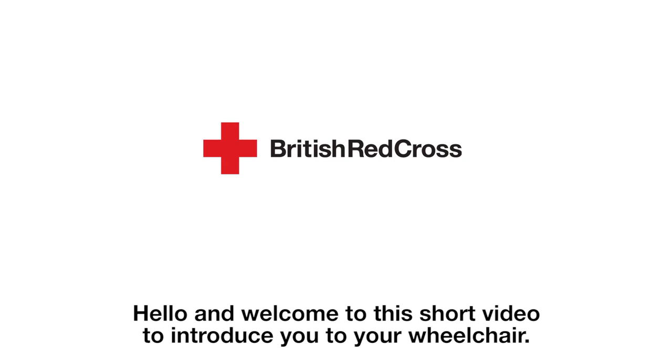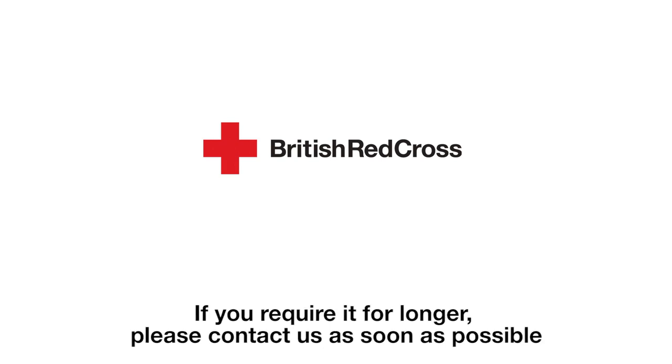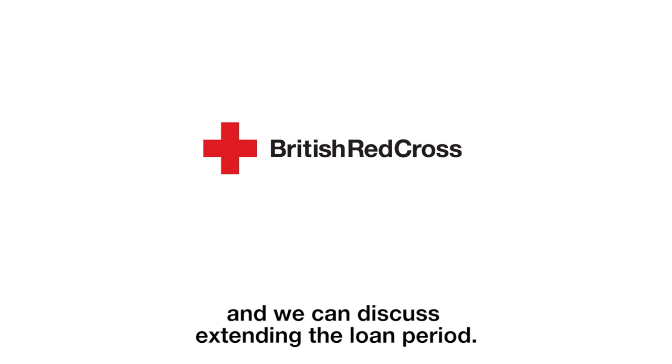Hello and welcome to this short video to introduce you to your wheelchair. This wheelchair has been loaned to you for an agreed fixed period. If you require it for longer, please contact us as soon as possible and we can discuss extending the loan period.